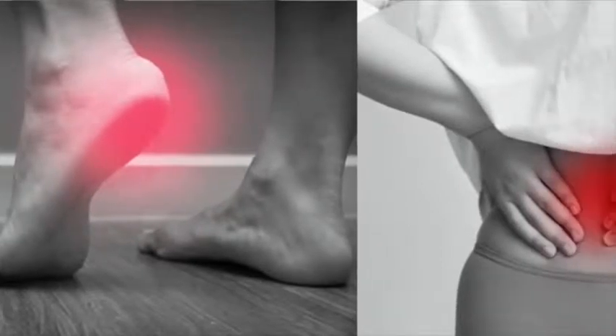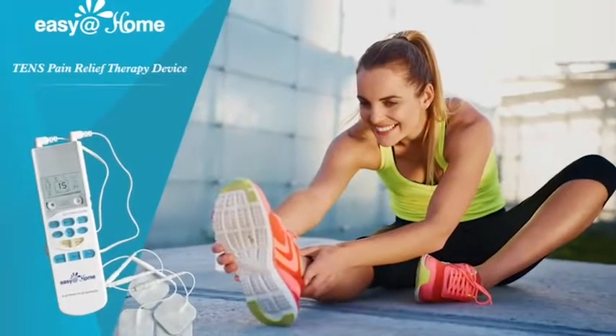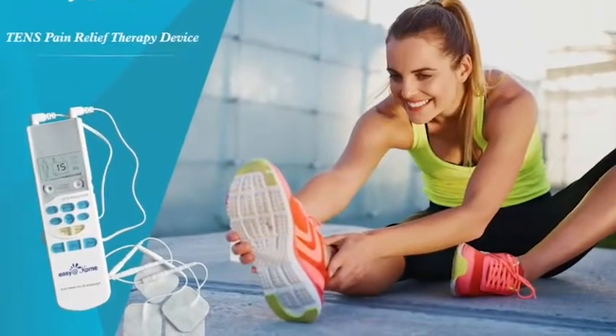Chronic and acute pain is quite common, affecting millions of people like yourself. Fortunately, there is a way to help you relax and reduce your pain symptoms.